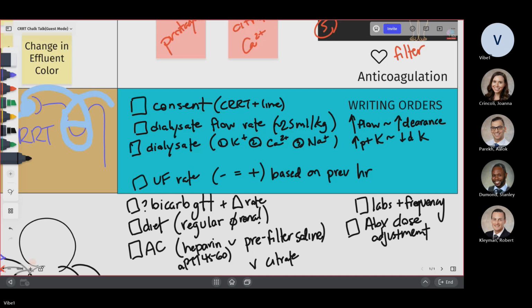Now if somebody comes in, let's say is hypotensive and is hyperkalemic, or somebody comes in has poisoning and is hypotensive, the modality of choice is still going to be hemodialysis, to put them on pressors and do dialysis, because in that way you can get good clearances and you can quickly correct their electrolyte or acid base disturbances. CRRT is for somebody who is getting volume overloaded, or you want to maintain their volume status, and those are where CRRT can help you, something like lithium poisoning.